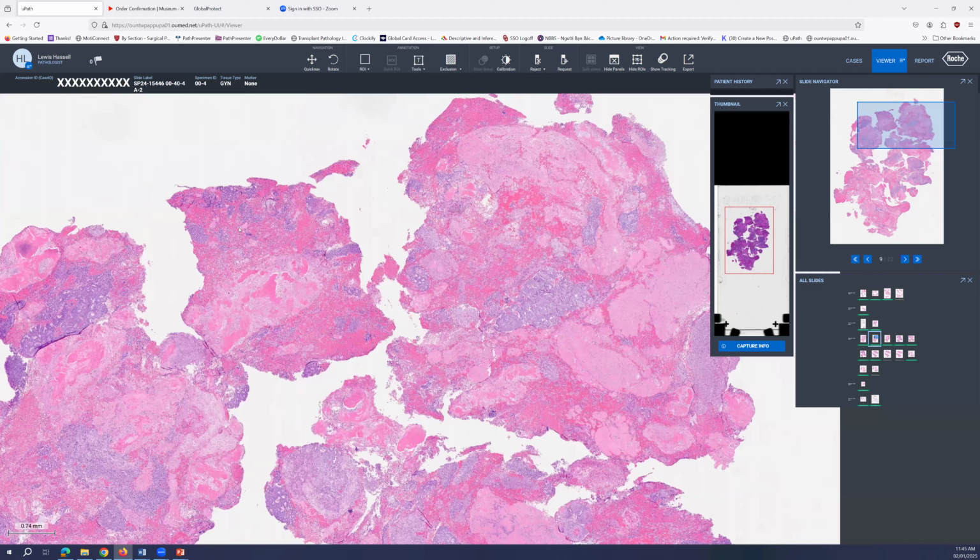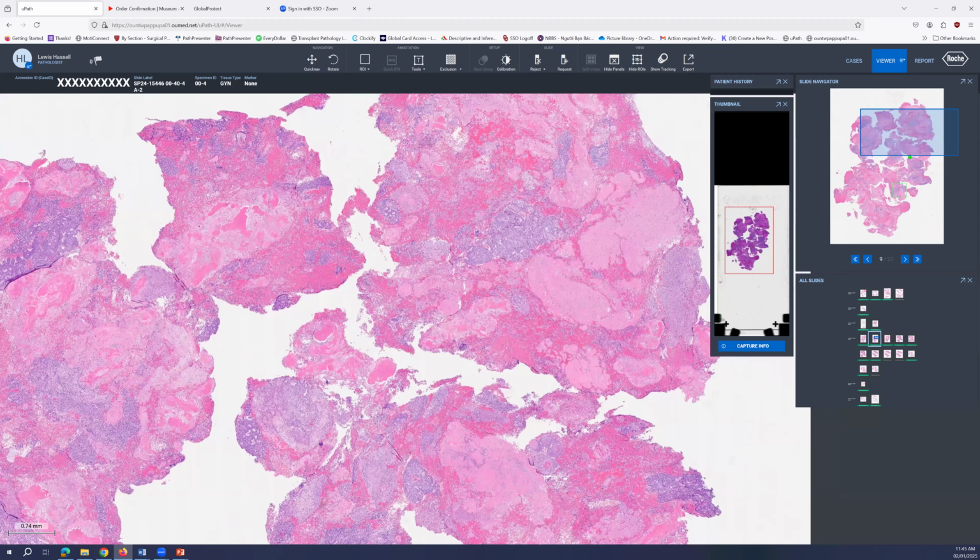Now, needless to say, we did some further immunohistochemical evaluation on this case, and the findings from that were quite instructive, particularly here in the endometrial sample, where we had a dual pattern of staining, or a dimorphic pattern of staining with several of the markers.